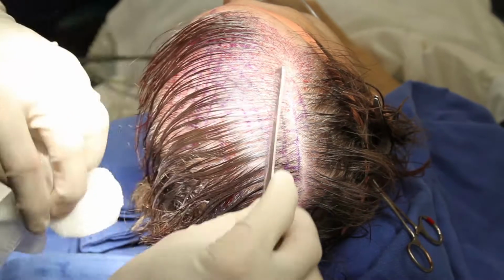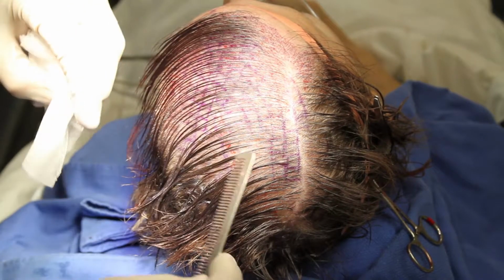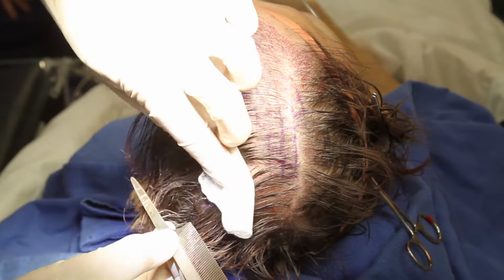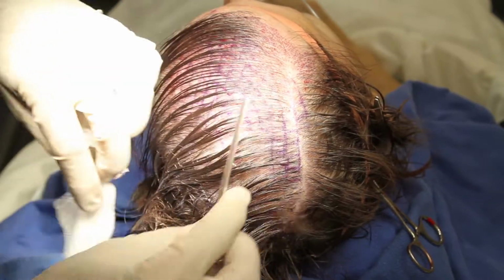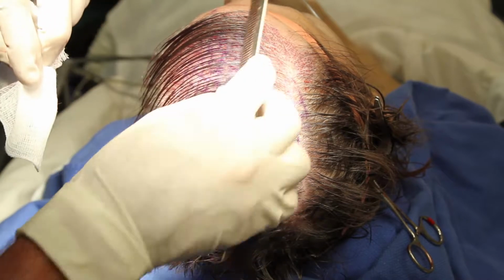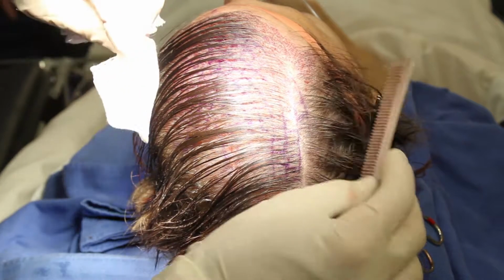This is one of our hair cases. This is a person who's had cranial surgery before, and there's a scar right down the center here that we're going to be completely obliterating by placing hair grafts in it. Now you see my pattern that I have under here marked very carefully into boxes. That gives me a number of square centimeters that I'm going to be grafting.